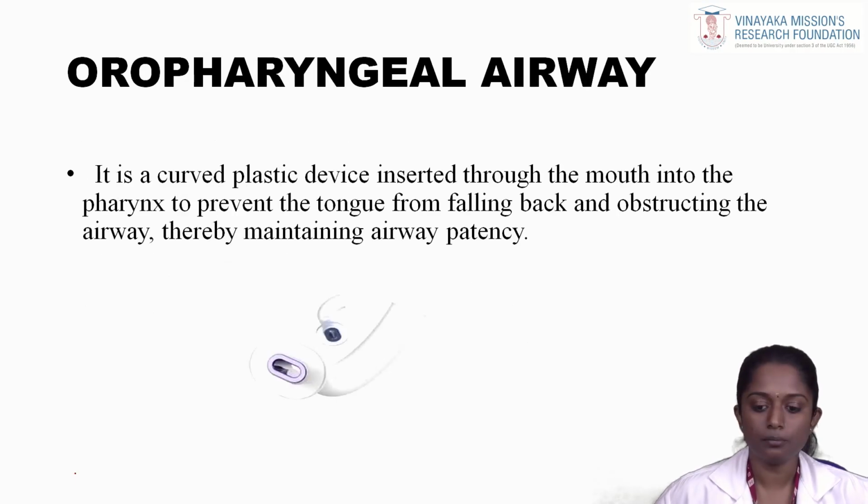Now next we will see about the oropharyngeal airway. What do you mean by oropharyngeal airway? It is a curved plastic device which is inserted through the mouth into the pharynx to prevent the tongue from falling back and obstructing the airway, thereby maintaining airway patency.